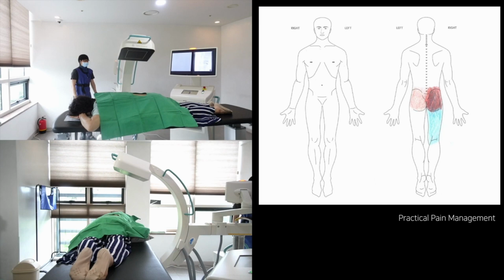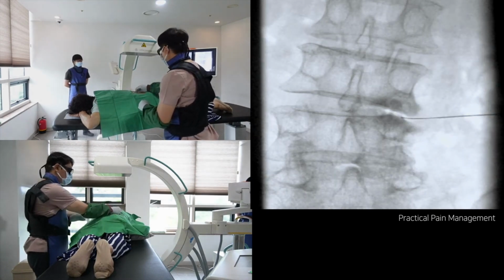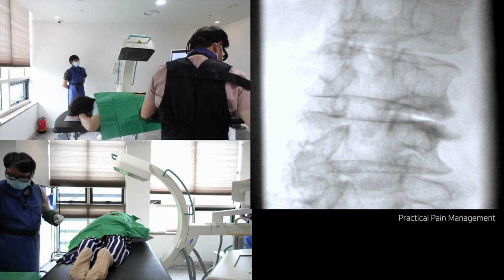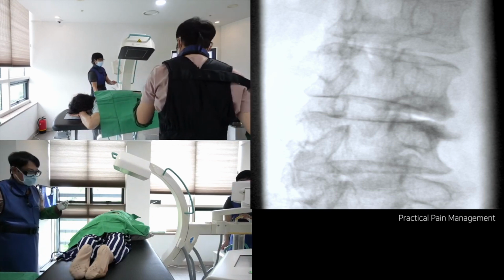Though this isn't an official term, I've coined it for clarity. I'll elaborate on the concept of adult discovertebral complex pain later. The technician has already adjusted the C-arm with a caudal tilt of 5 degrees and a right ipsilateral oblique tilt of 30 degrees. Bony sclerosis is observed in the lower subchondral bone of L3 and the upper subchondral bone of L4, accompanied by disc space narrowing.